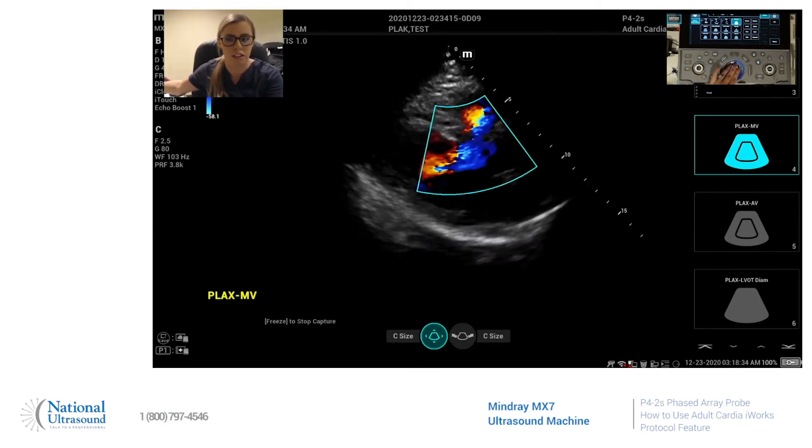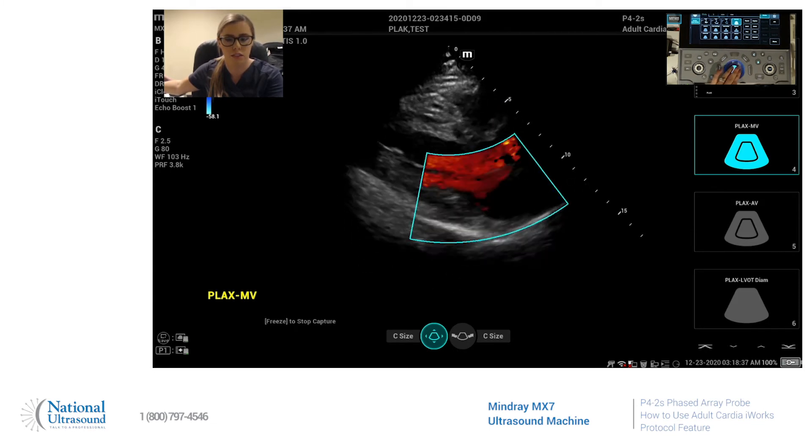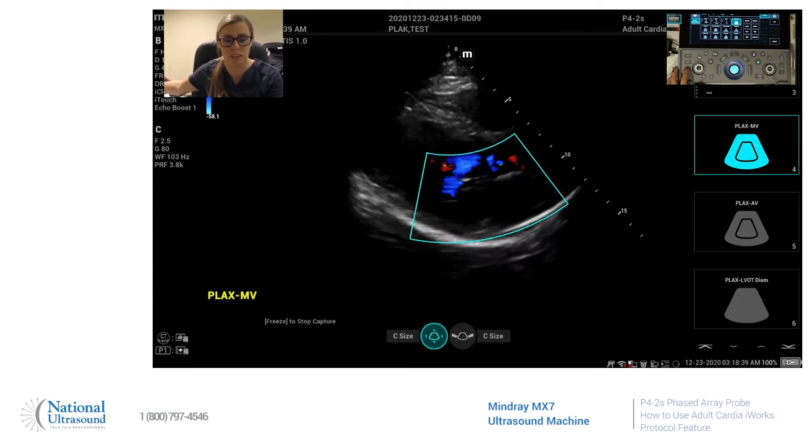Next it asks you to do color of the mitral valve. You can move it down and acquire that when you're ready.